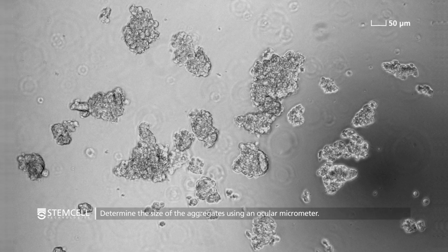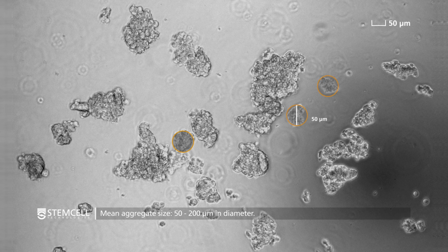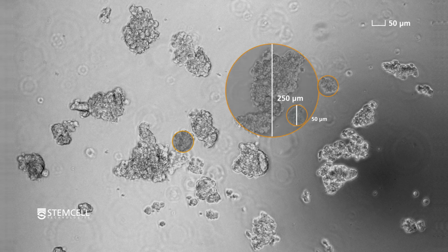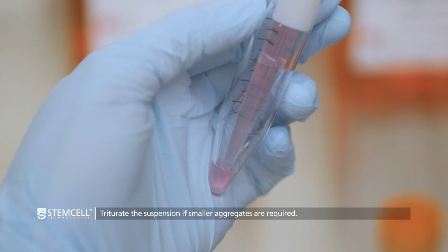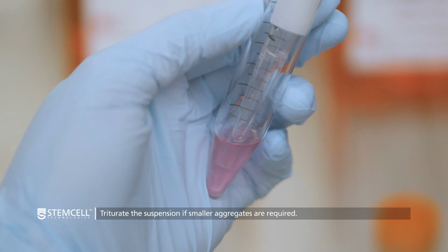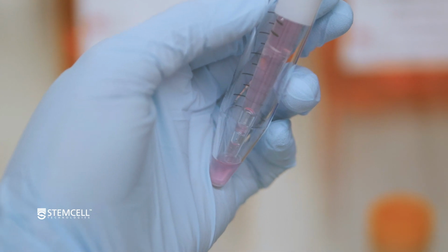Examine an aliquot of the aggregate suspension under a microscope fitted with an ocular micrometer to determine the size of the aggregates generated. Mean aggregate size should be between 50 to 200 micrometers in diameter. If the majority of the aggregates are above 200 micrometers, triturate the aggregate suspension by pipetting the suspension up and down with a 5 milliliter serological pipette until the desired aggregate size is generated.